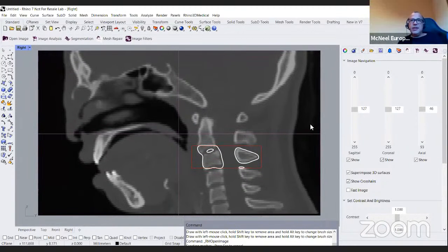Carlos Benito asks if there are automatic segmentation tools. Yes, so automatic. It depends a lot on the project. The more information you have about what you want to automate, the better. Because what we offer is an API to automate your process.